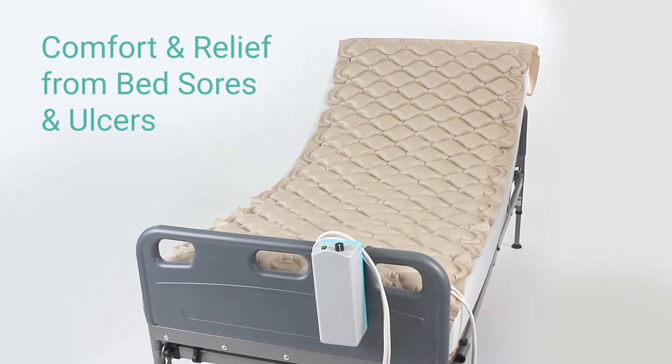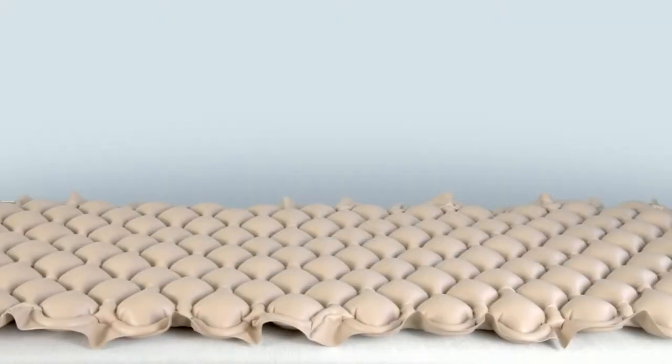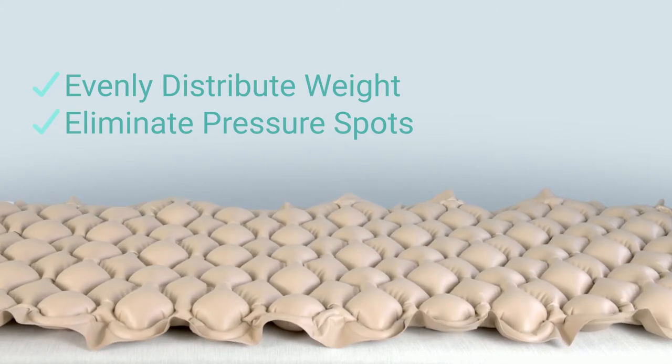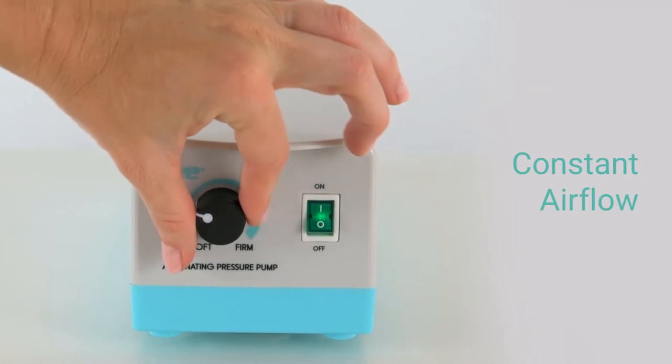The alternating pressure mattress by Vive provides comfort and relief from bed sores and ulcers. 130 air cells alternately inflate and deflate to evenly distribute weight, eliminate pressure spots, and increase circulation. The quiet variable pressure pump produces constant airflow.